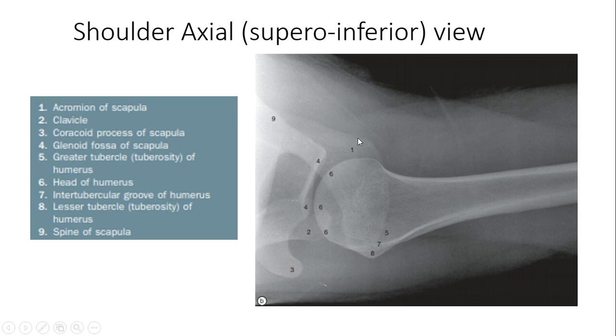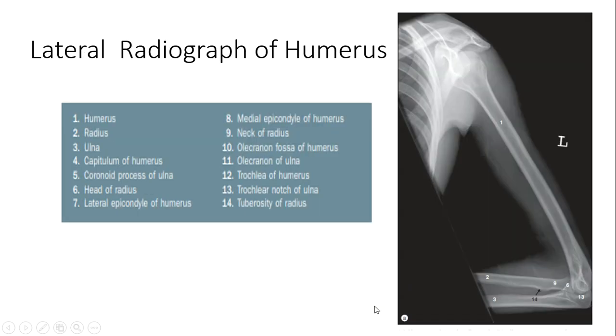This bone, you can see, this is the acromial process of the scapula, and this is the acromion, and you can see the acromial end of the clavicle, which is forming the acromioclavicular joint, and this joint lies on the superior aspect of the shoulder joint. You see these joints are overlapping in this view, while in the previous film, you could see them.